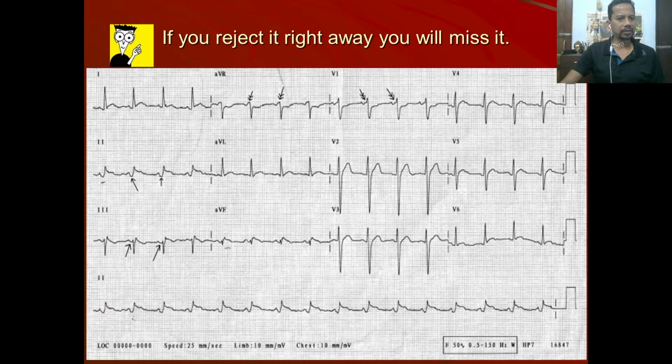This is the finest of the topics, and atrial MI we will never even think of if we are not looking for it. So whenever the patient comes with atrial fibrillation, think of atrial MI. Let the fibrillation settle down and atrial MI might be there. Sometimes the patient comes, you do the ECG, trop T is positive, ECG is normal. So think of atrial MI. This is another take home message.